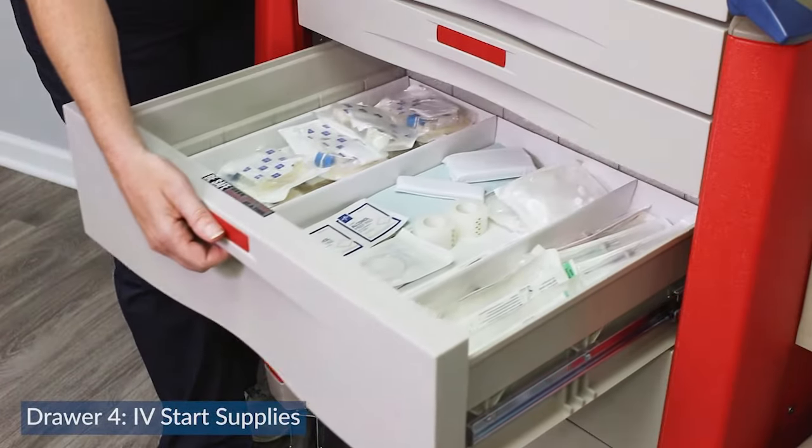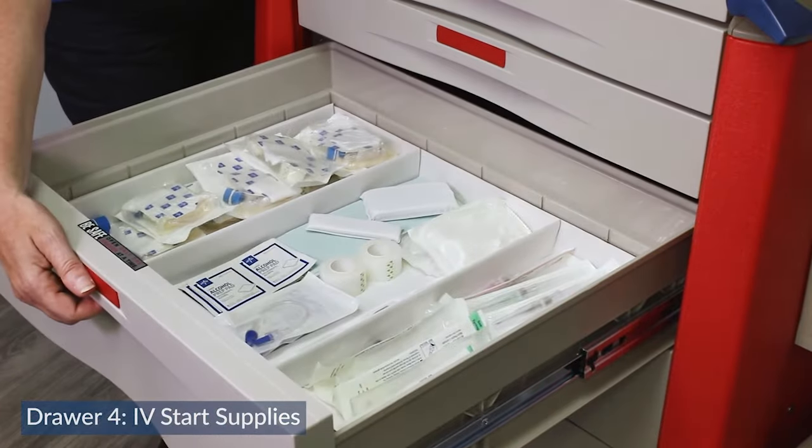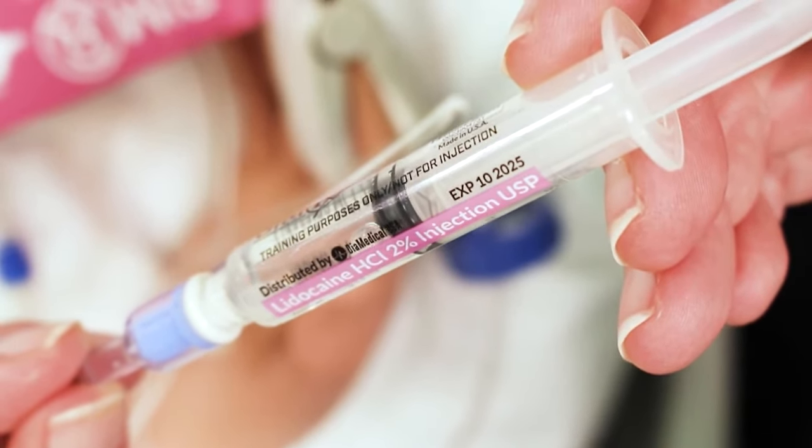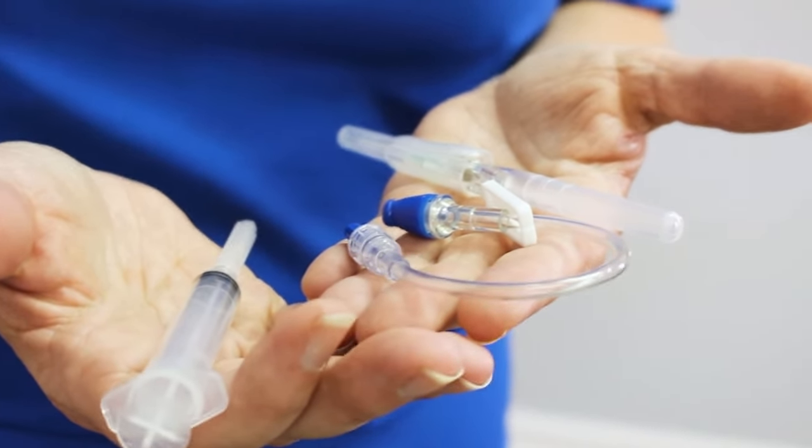The fourth drawer contains all of our IV start supplies. All those medications given in an emergency are given through an IV, and this drawer has everything that we need to start an IV.